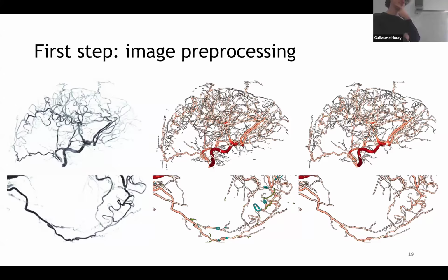But obviously, the long-term plan is to have the visualization method attached to maybe deep learning techniques for a more, let's say, mundane image acquisition pipeline. But here, our method doesn't really deal with this step anyway. So we'll just assume that we already have the topologically accurate segmentation on the right as input.